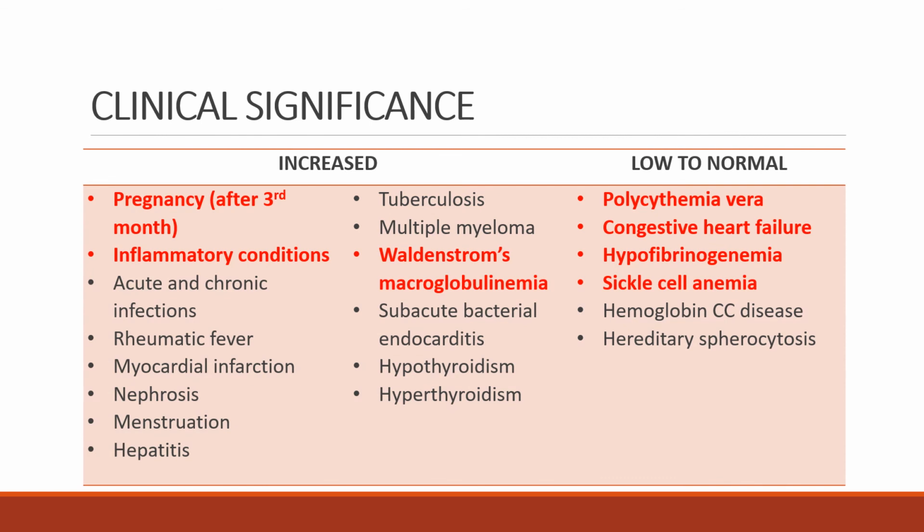This slide shows you the clinical significance of the ESR result. So if the ESR is increased, the following conditions may be the reason why the result is increased, like pregnancy after the 3rd month, inflammatory conditions, Waldenstrom's macroglobulinemia, and other conditions.